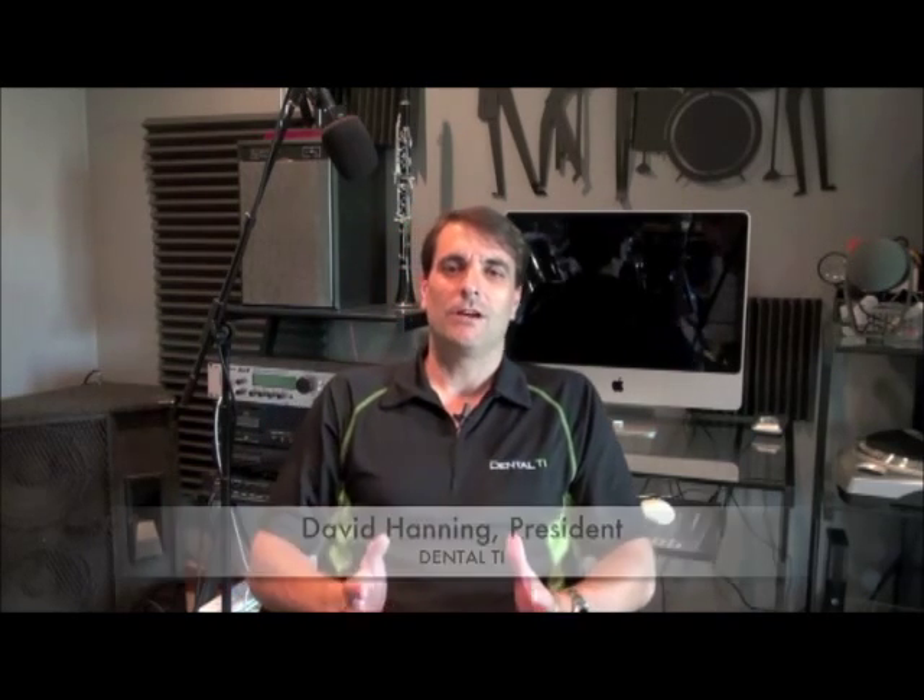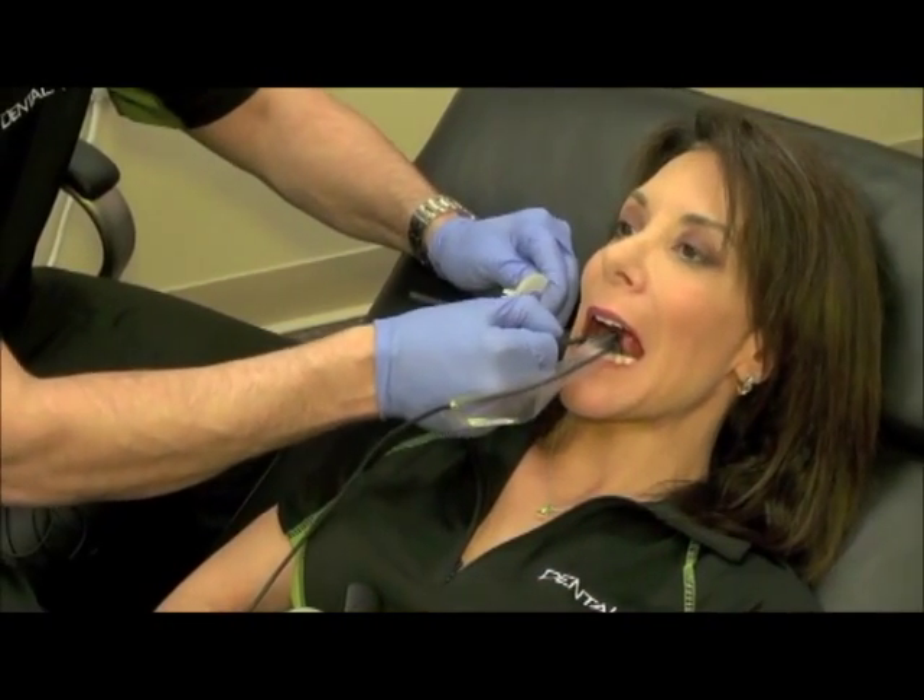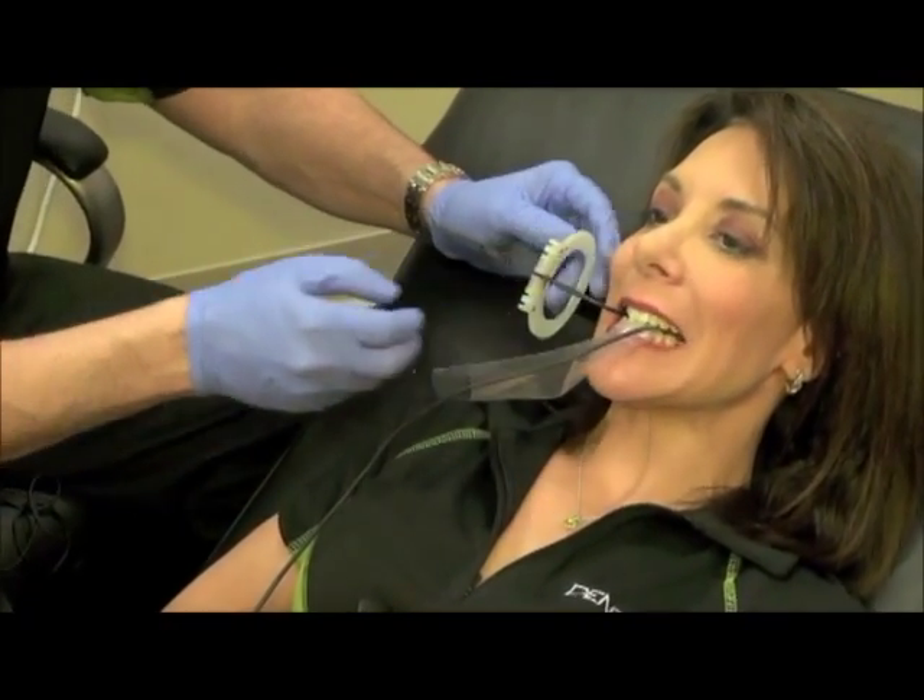Hi, I'm David Hanning with DentalTI. Today we're going to talk about one of the most important elements to getting great digital x-rays, and that is positioning that sensor comfortably. When you use correct holders like the Trollbike Camara for paralleling, it makes everything easy.